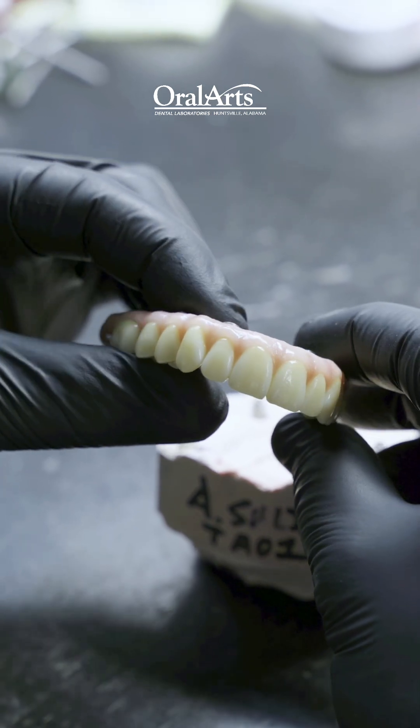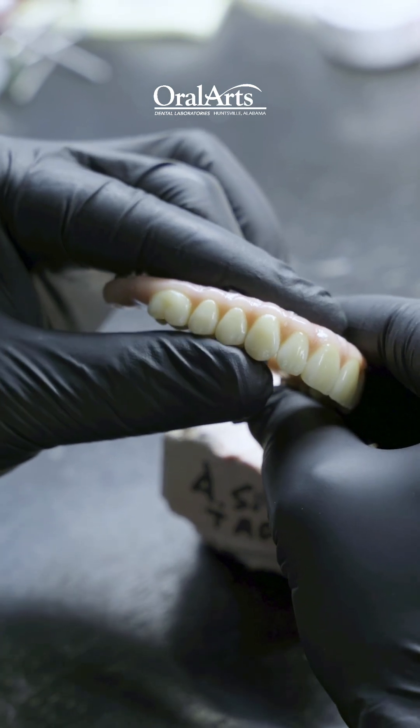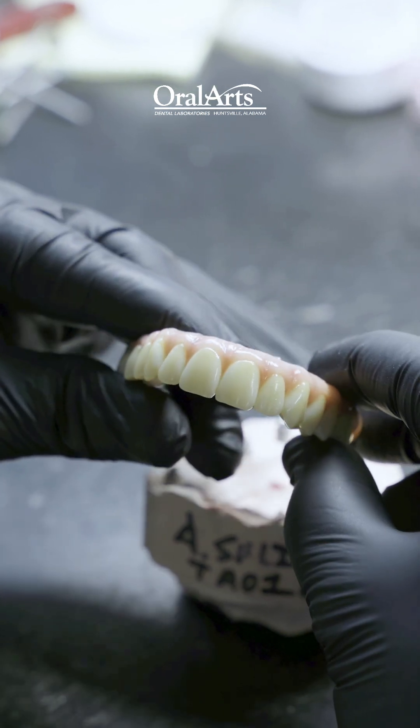On this particular example, all of the teeth are very well defined and individualized, with wonderful morphology and anatomy texture added to this prosthesis.